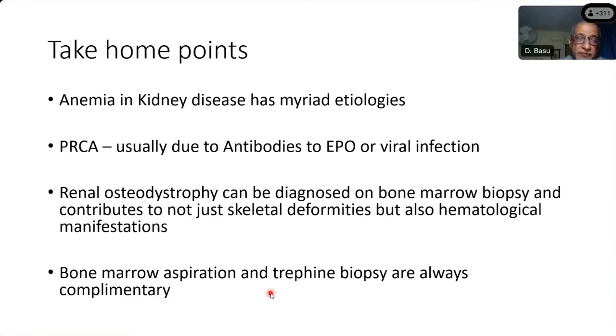Yes, sir. And another question is, we didn't see any megakaryocytes in the section studied. Yeah, I did not focus on that; megakaryocytes are kind of localized. Those areas where I was trying to take the picture for the erythroid, megakaryocytes were unfortunately not there. There was adequate megakaryopoiesis in this biopsy, but for showing the photographs, I had to take photographs where the erythroid cells were present. In those areas, unfortunately, megakaryocytes were not there.